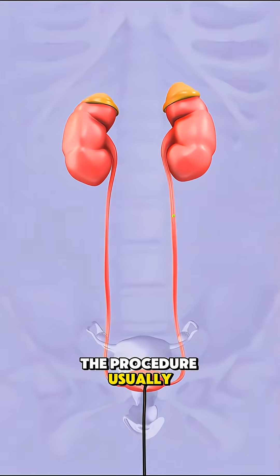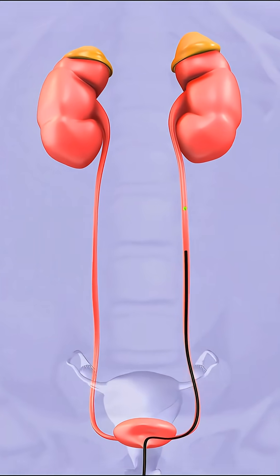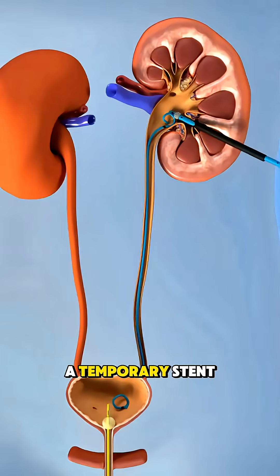The procedure usually takes under an hour and is done under anesthesia. In some cases, a temporary stent is placed in the ureter to keep it open and allow healing.